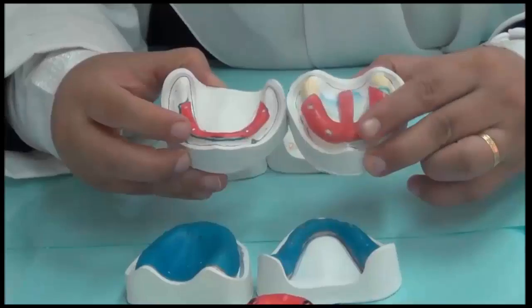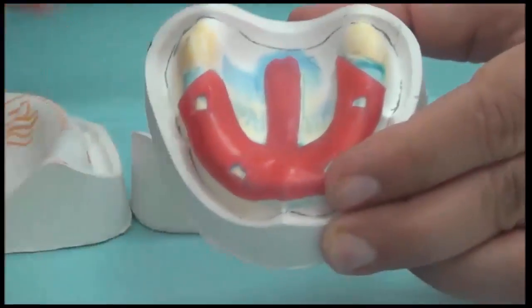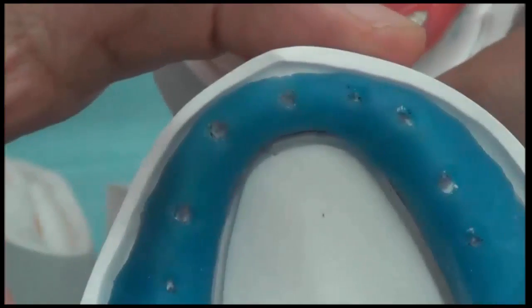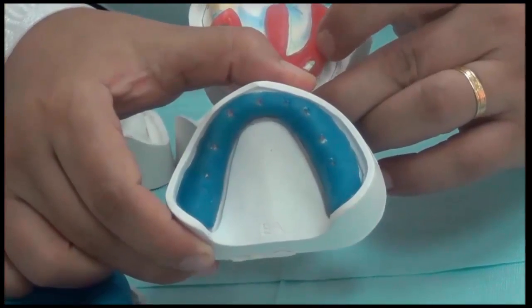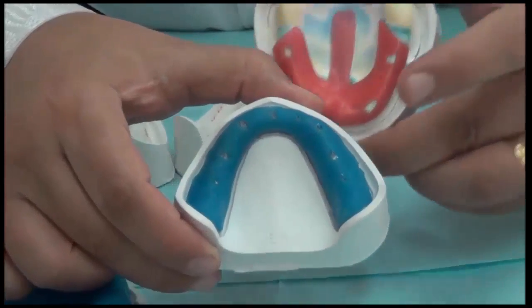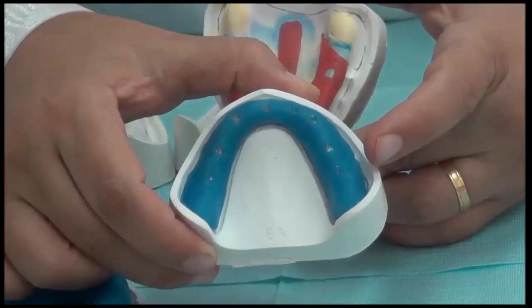For your lab work, you will be doing the upper partial relief wax, and then we will place the tray material over it. And for the lower, you're going to do the perforated way of relief, for you to gain experience in both methods of relief. So for the upper we're going to do partial relief, and for the lower we're going to do whole relief against the tissue that we need to be static.